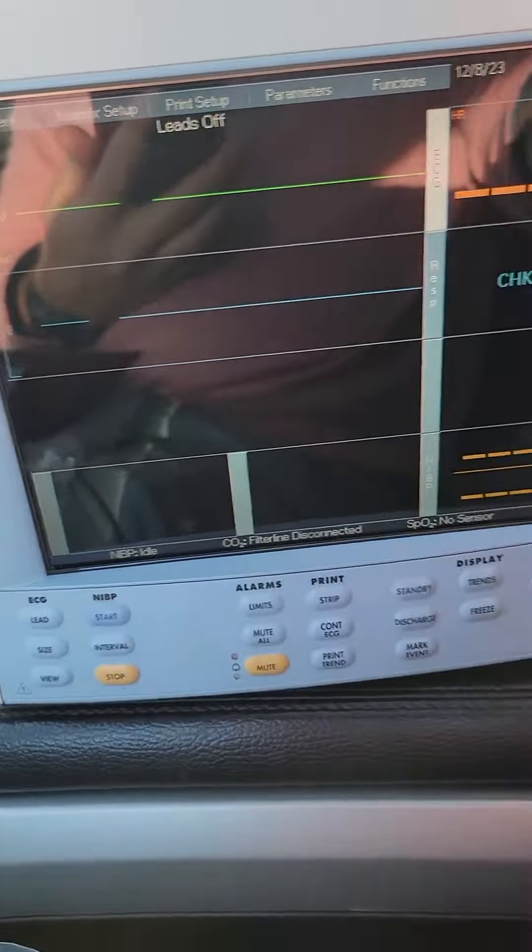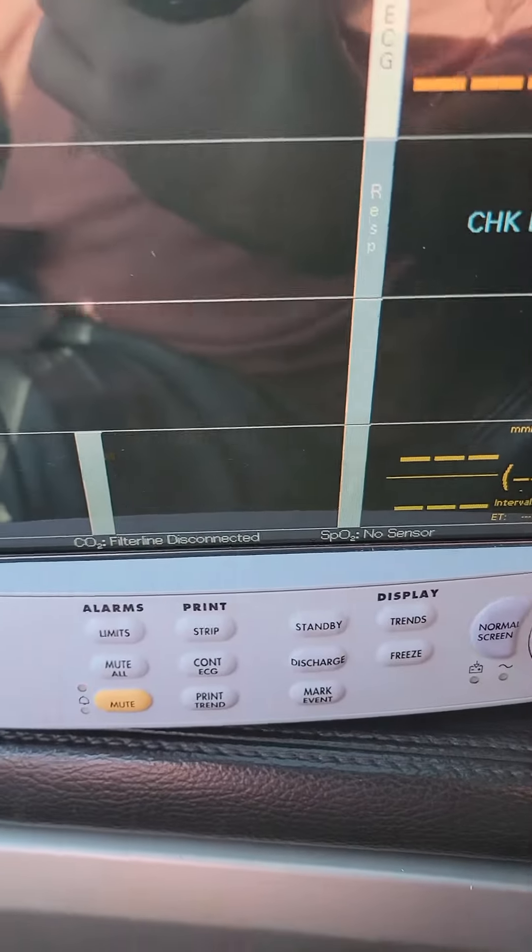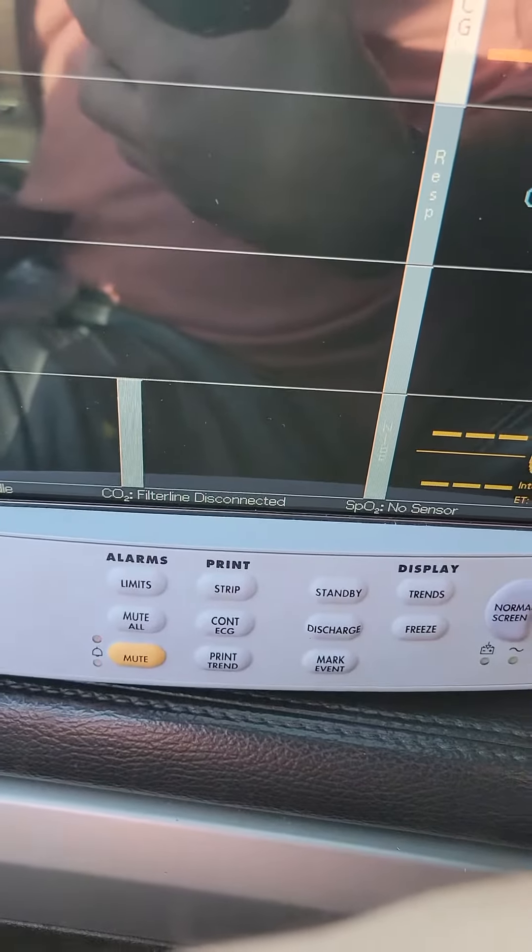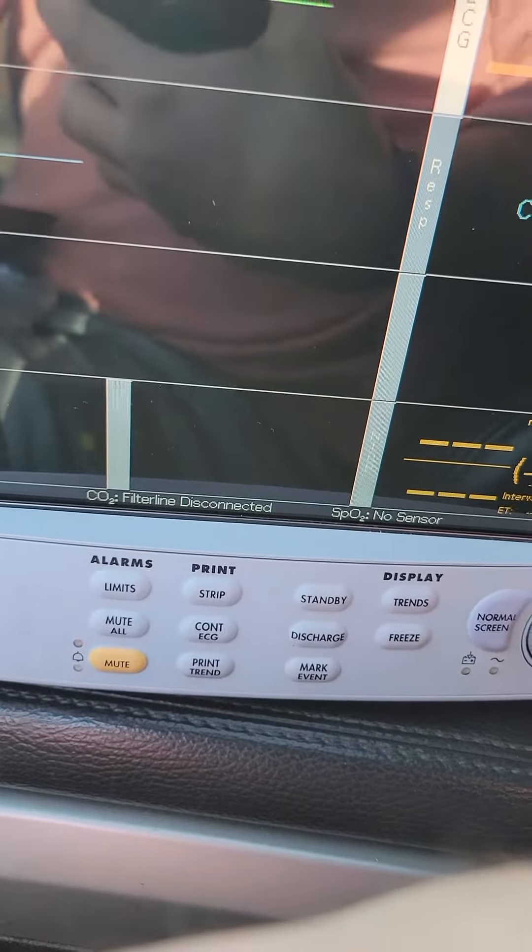But see, look. Right here, I'm hooked up. Nothing. Take it back off that. Roll down ECG cable. 3-lead.